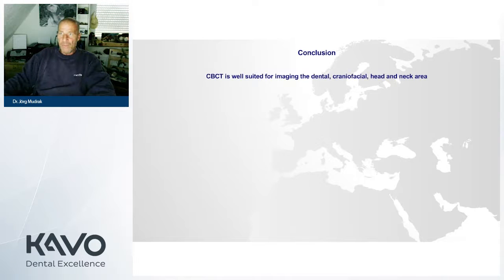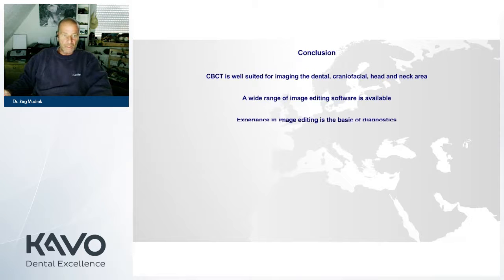Conclusion. I think that we agree that cone beam computed tomography is quite well suited for imaging in the dental, craniofacial, head and neck area. I want to point out there is a lot of software on the market, and we need to find the one where the workflow is the most convenient for us. We need experience in image editing. It's the basis of all diagnostics.